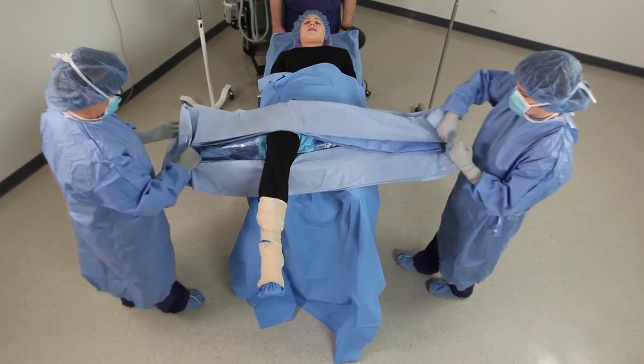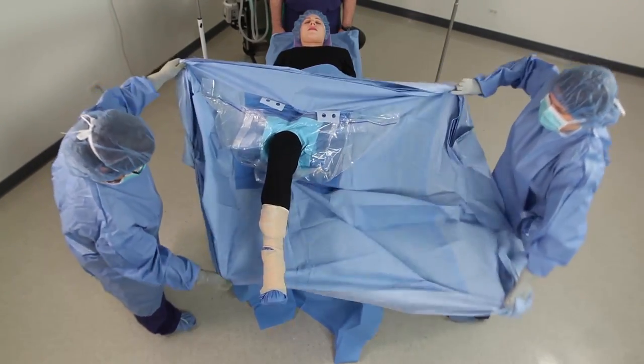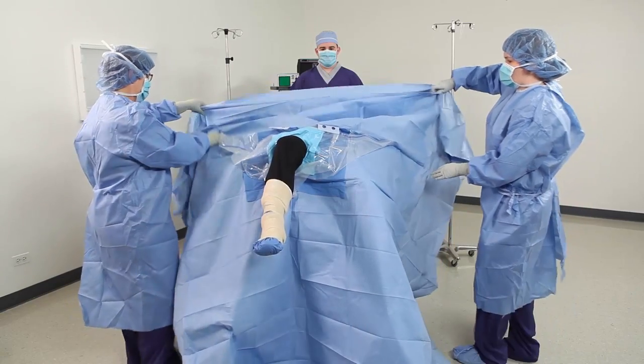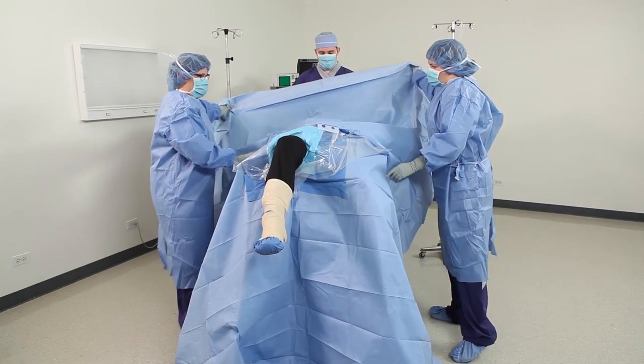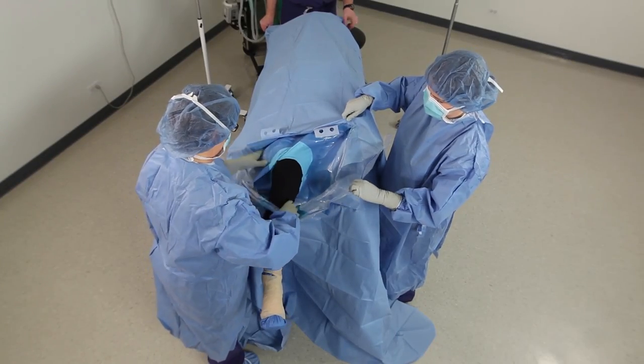Next, unfold the drape side to side, unfold to feet, and unfold to the head. Now, to form the pouch, move the lower panel of the pouch to below the knee.